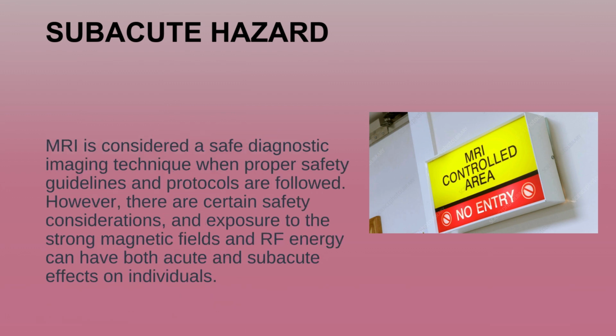MRI is considered a safe diagnostic imaging technique when proper safety guidelines and protocols are followed. However, there are certain safety considerations, and exposure to the strong magnetic fields and RF energy can have both acute and subacute effects on individuals.